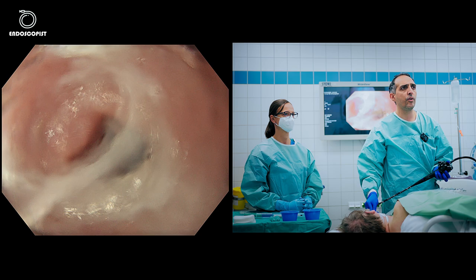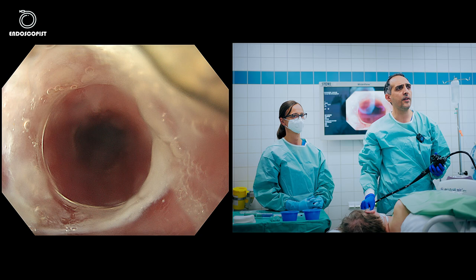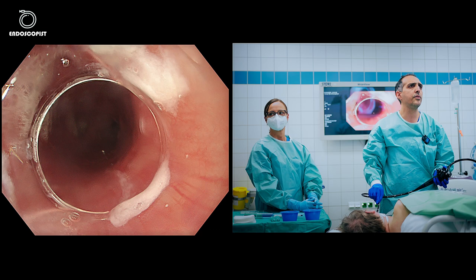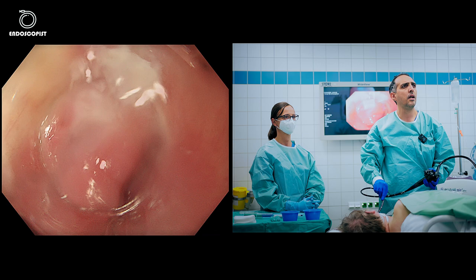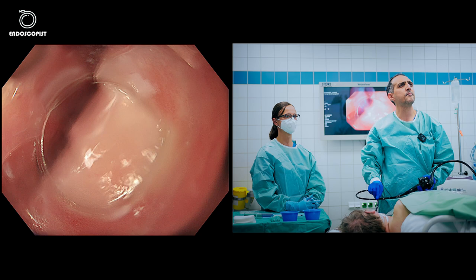We'll have a quick look to confirm the stomach is empty before starting. The stomach is quite empty. I'll withdraw the scope very slowly to the upper esophageal sphincter. Here is the sphincter and we can see the septum of the diverticulum. I'll try to intubate the diverticulum — it has some fluid remnants and is approximately three centimeters in size.